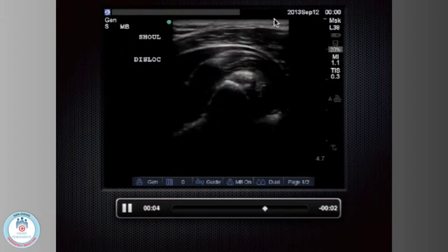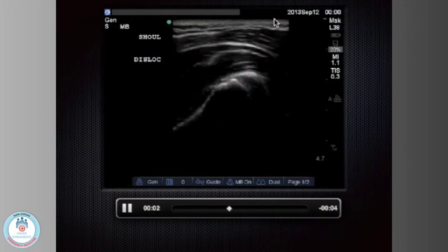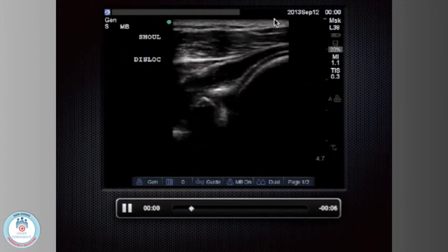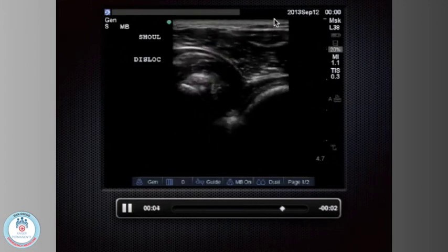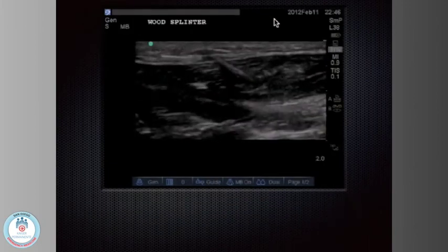We took college students and put them in the room, taught them how to do ultrasound for shoulder dislocation. We said, this is how you do it, have at it. And they were 100% accurate. They could pick out the dislocations. They had 20 positives and like 130 true negatives, and so they didn't miss anything. These were not doctors, college students.